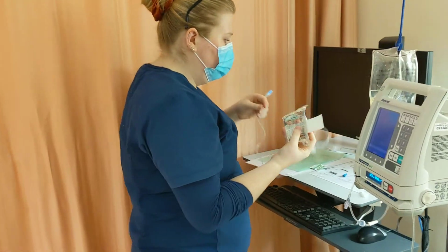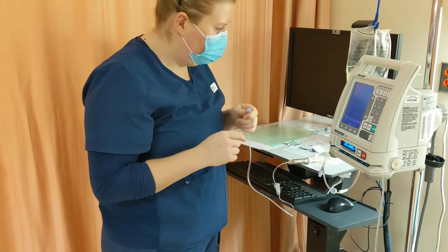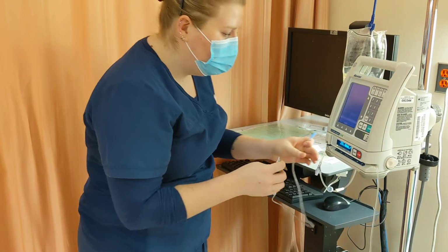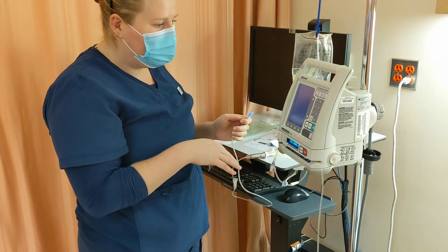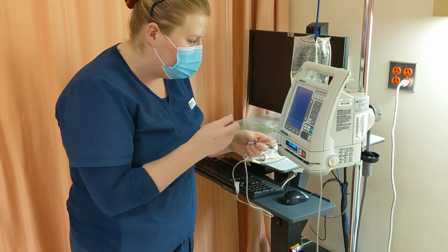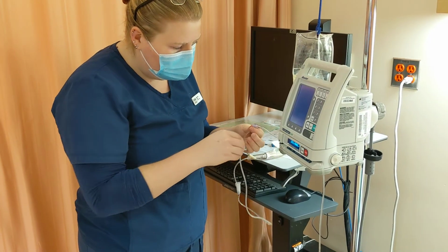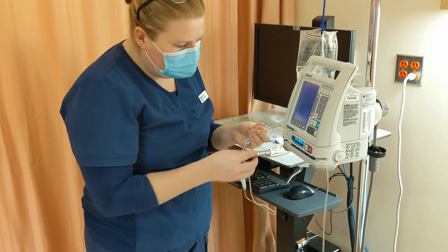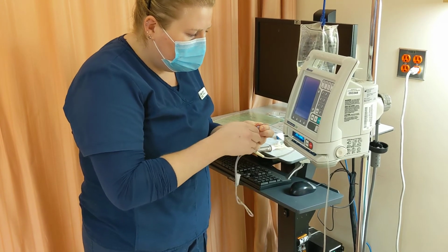Once I've done that, I'm going to put this medication down and make sure that this is closed so that I can attach this to the port here. I'm going to take my alcohol swab and swab the Y port that's behind the Baxter pump, because this is the right one for secondary. I'm going to swab for 30 seconds in a circular motion and let it dry. Not letting go of this because we don't want to break sterility. I'm just going to take this, not touching that, and we're good.